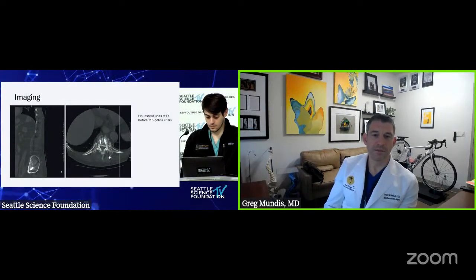Yeah, I think it's an important consideration. I think if her DEXA was minus 1.4, that's kind of the best data we have. So I don't think I would fault the bone quality. The Hounsfield units would make me a bit concerned about stopping points as far as UIV, et cetera.